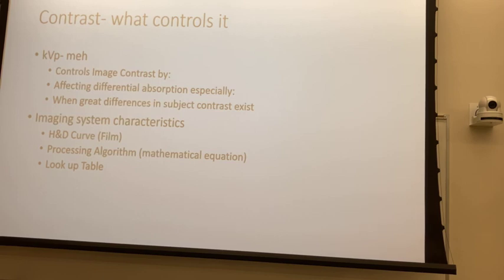As opposed to a chest X-ray, do you want high contrast on chest X-ray? No, you want to see a lot of different shades of gray. So the lookup table, or the H&D curve that is representative of the lookup table for low contrast, we'll say this is a hand, this is a chest X-ray, is going to take more exposure in between density levels.